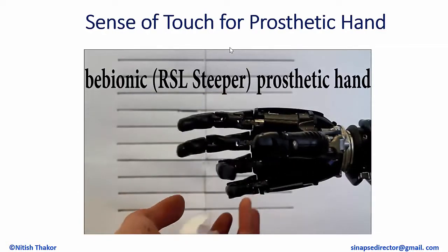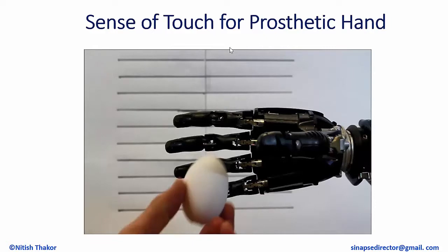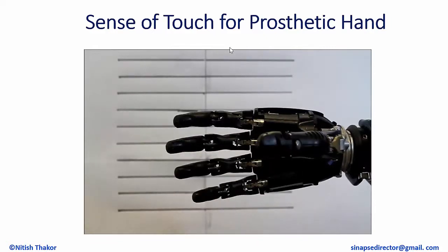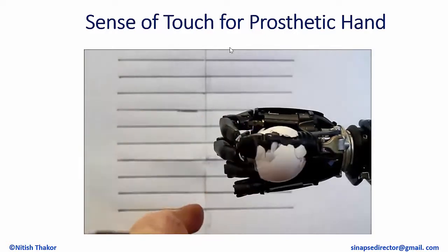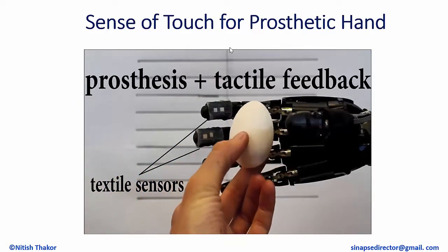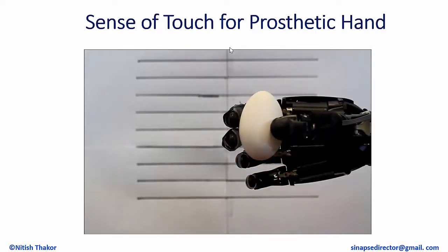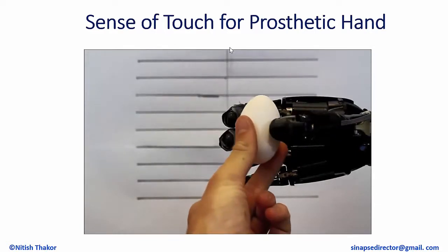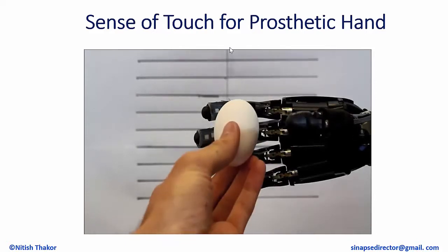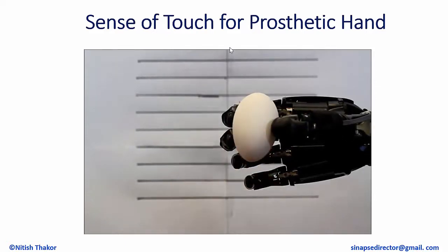This is what makes research fun for graduate students. So my graduate students say, oh, okay, a prosthetic hand, if it has to touch an egg, of course it'll break. By the way, you can eat a lot of eggs this way. But with tactile feedback, you can handle very delicate objects as well. So this prosthetic hand with a touch sensor is able to handle delicate objects.